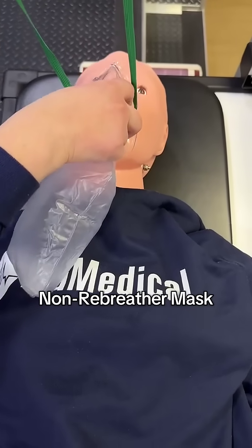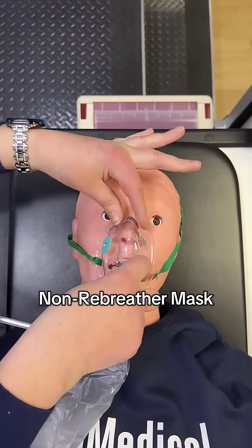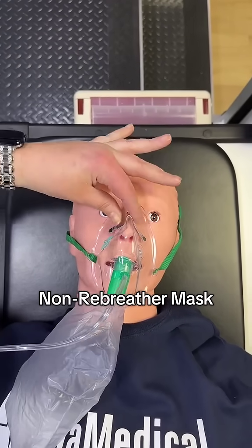Holding the mask in one hand and the strap in the other, place the mask in contact with the face first, and then wrap the strap around. Pinch the nose to keep it in place.